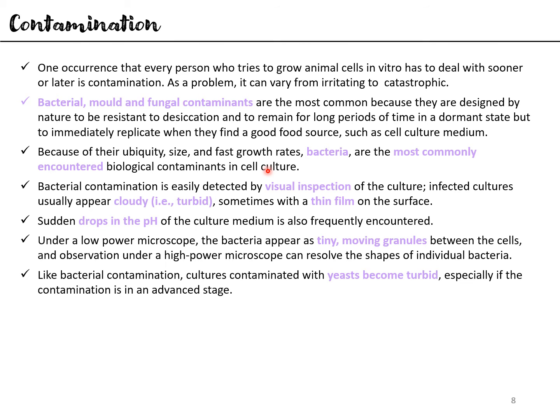And that is why, to avoid contamination, we typically take a lot of precautions. So mostly you would see that your cell culture facilities have a double door system. That is, you first open the first door which leads to outside, and you enter into this secluded space. Once you've closed the first door, then you open the second door, and now you enter into your cell culture room. Also, your doors mostly would be fitted with one of those things that dispense air at you at a high pressure when you're entering the door. So this will typically remove any spores of yeast or bacteria or these toast crumbs that you might have on your t-shirt or on your clothes.